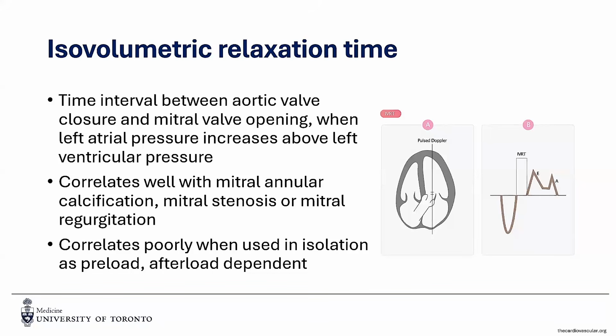It is, however, quite useful in mitral annular calcification, in mitral stenosis, and mitral regurgitation, because we're not looking at flows directly, nor are we looking at the properties of the mitral annulus directly either.